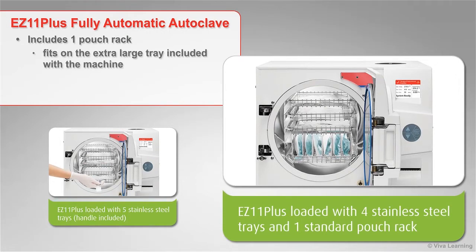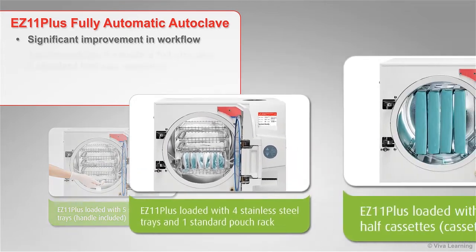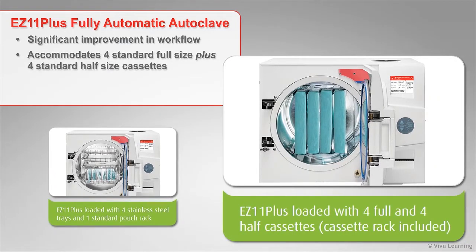The rack fits on the extra-large tray included with the machine. The pouches and packs are then loaded vertically on the rack, allowing you to sterilize more instruments during each cycle. This can provide a significant improvement in workflow. And if your office uses cassettes, simply remove the trays and the EZ 11 Plus can accommodate four standard full-size plus four standard half-size cassettes in each load on the rack that is included with the sterilizer.